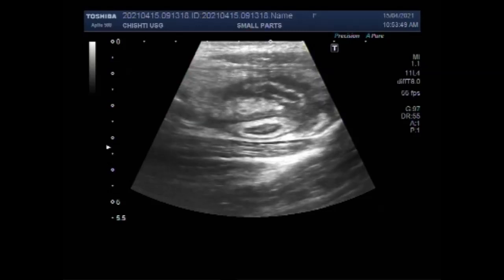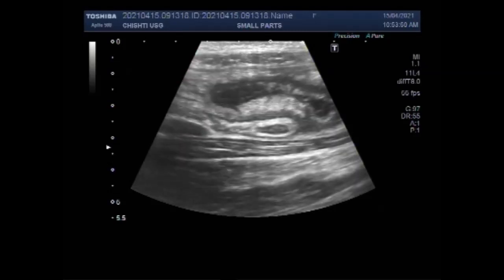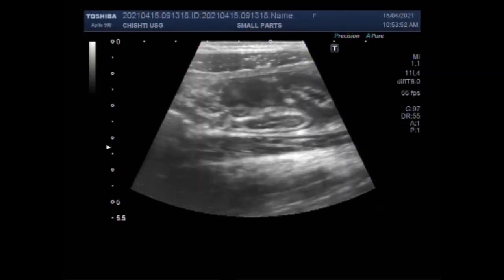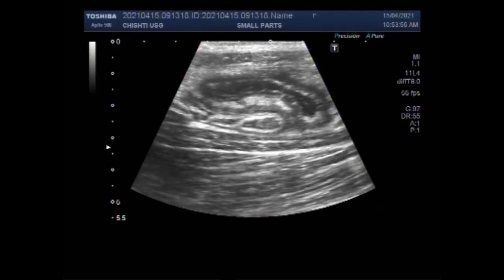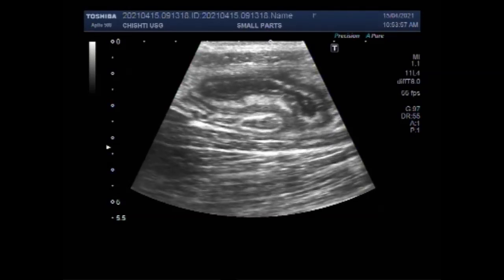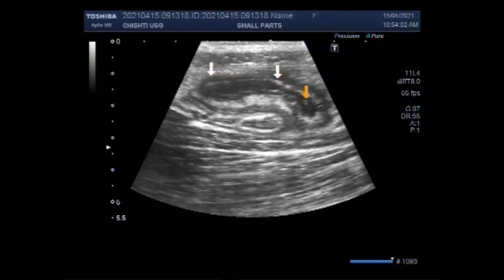Now this is a case where the patient is experiencing severe pain in the right iliac fossa. When acute appendicitis is suspected, you can scan the patient lying supine, using a high-frequency transducer of 7 to 11 megahertz. You may put a pillow under both knees to have the abdomen of the patient relaxed.